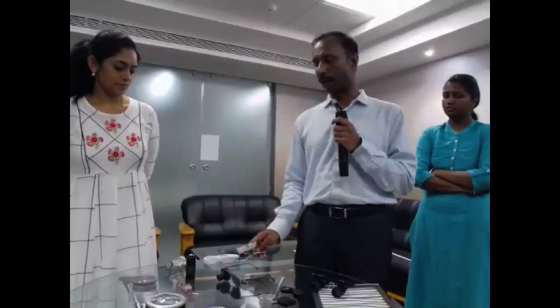Now, many times the question comes up that you are dispensing low vision aids but only for one eye. What happens is, in the majority of cases, I would say maybe 80% of the patients prefer viewing through only one eye because the vision is better in that eye. In such cases, binocular vision has not been a cause of problem or strain for the patient. This offers up to 6 times zooming capacity. If we go for a binocular device, that offers 2 times magnification.